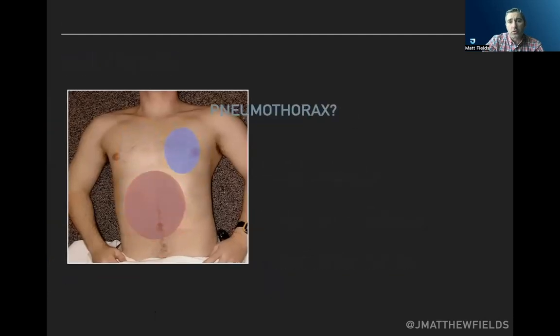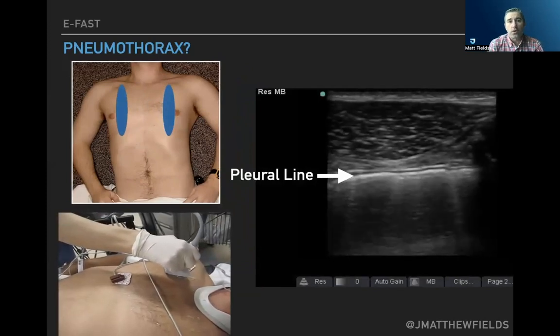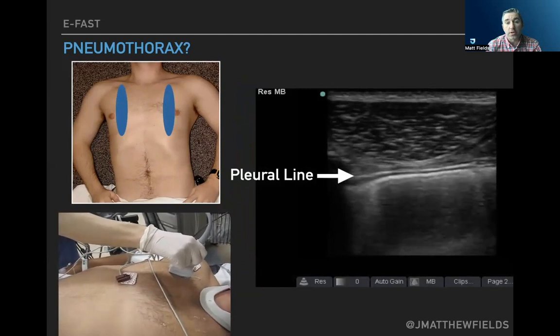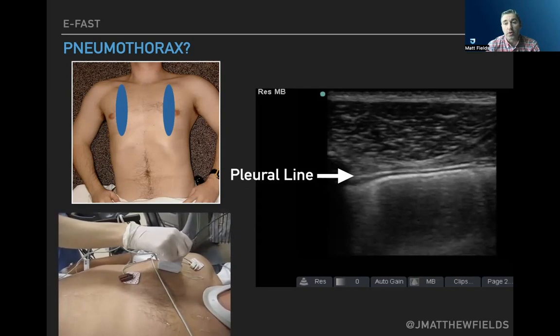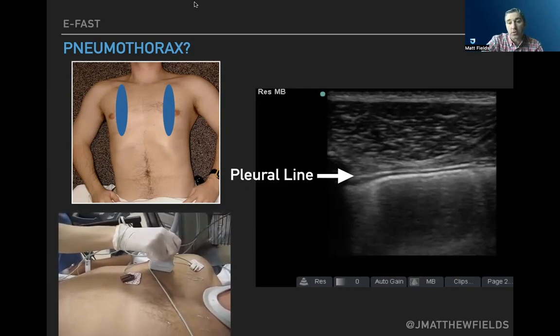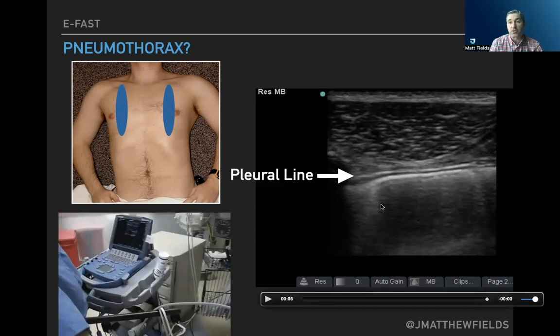Moving on into pneumothorax. So here we are scanning anteriorly with the probe oriented towards the patient's head. And we're identifying the ribs, as we can see, as that kind of shadowing structure on the image left here. And then this hyperechoic pleural line where we see the apposition of the visceral and parietal pleura. And below that, we're seeing air, whether that's normal lung with alveoli, or actually free air in between the pleura from a pneumothorax. It's going to look similar.